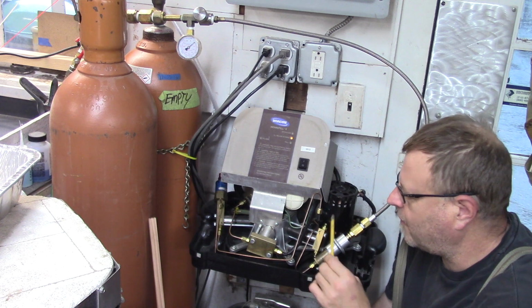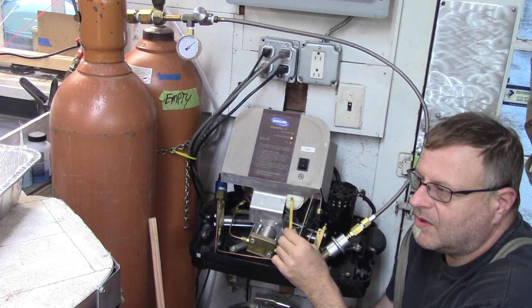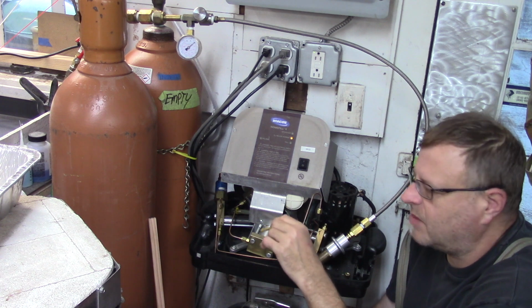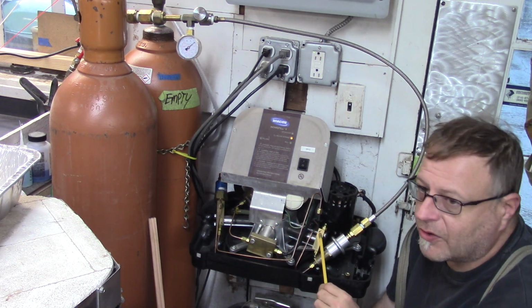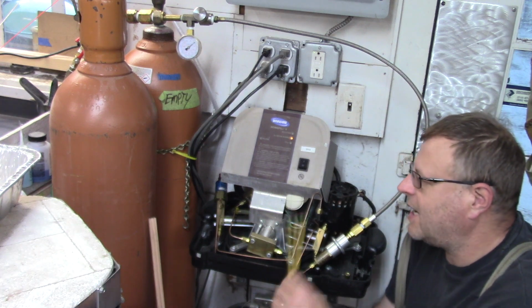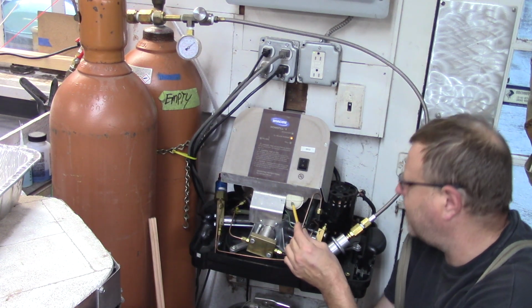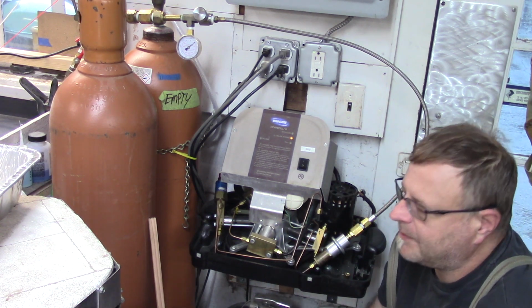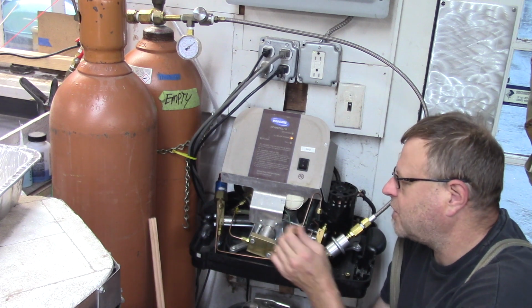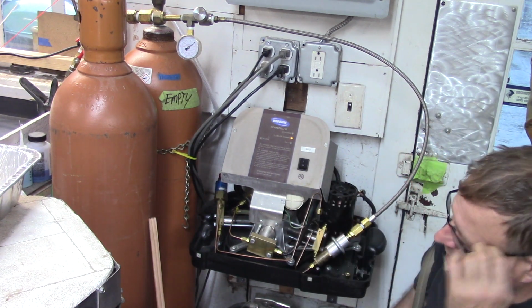The other thing is I'm running it with open cylinder heads, and by doing so, I've bypassed all of the mechanical stuff that makes the oxygen that comes into this dry. So the chances are that I'm going to further score these cylinder bores because of moisture in the air. These things want to be dry. I've seen a couple people bypass the electronic wizardry that makes this thing work, and I don't think it's a great idea. This is an accumulator tank with a desiccant in it. Oxygen wants to be dry. All compressed gases want to be dry. They're never going to be anhydrous, but at least they'll be dry. Because if the cylinders aren't dry on the inside, eventually the cylinder bores are going to get scored by just corrosion.